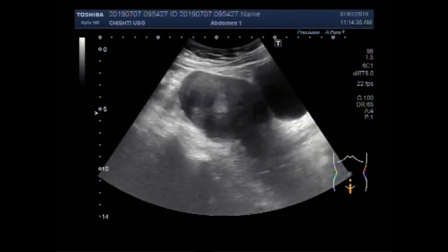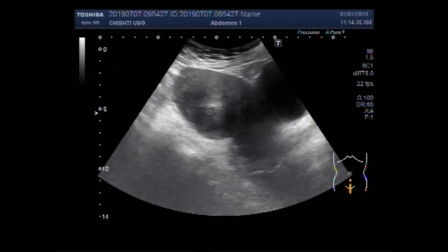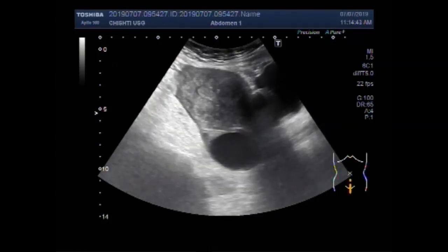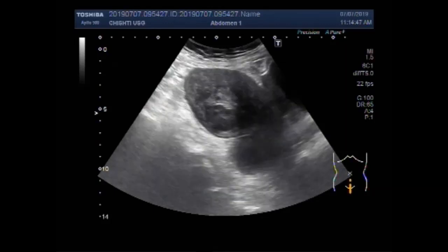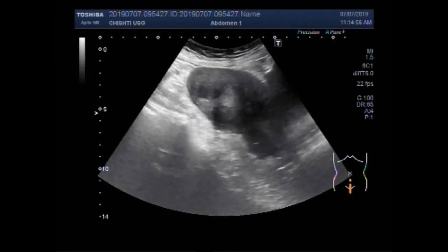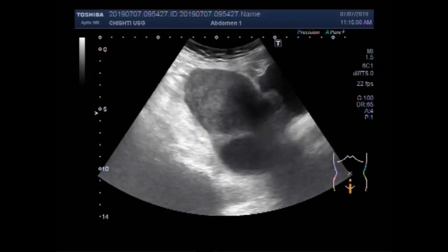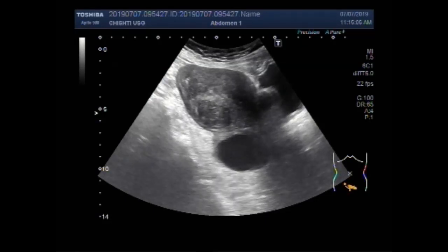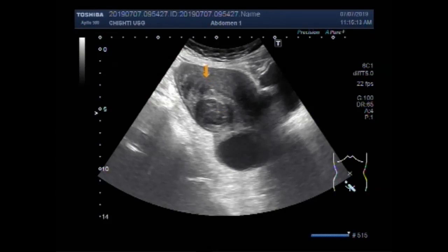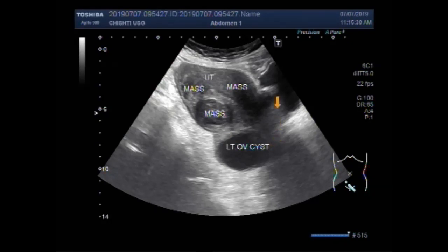You can see the uterus having three masses. You can see these masses and an ovarian cyst. This is the uterus, and this is the mass in the distal portion of the uterus. This is the mass in the middle portion of the uterus near the posterior wall, and this mass is also in the middle portion of the uterus near the anterior wall. This is the left ovarian cyst and this is the urinary bladder.